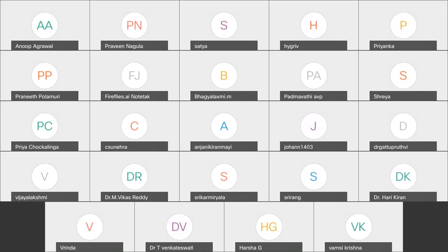terms that you have an apex which is more than 15 mm. This is the MRI definition. And the apical wall to basal wall, there's a ratio of more than 1.5:1. And you get a classical spade-like configuration of the LV cavity at end diastole, which is really best seen in the vertical long axis view in MR terms or in a two-chamber view in echo terms. So this is basically how we make this diagnosis.